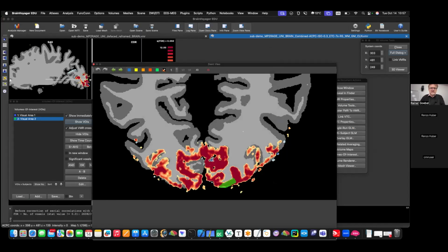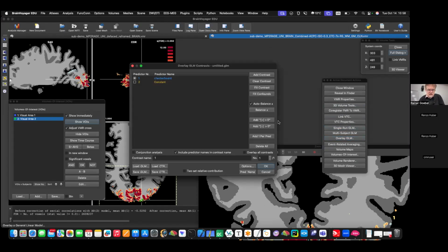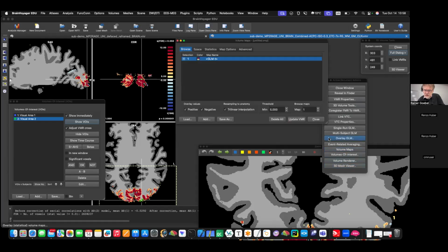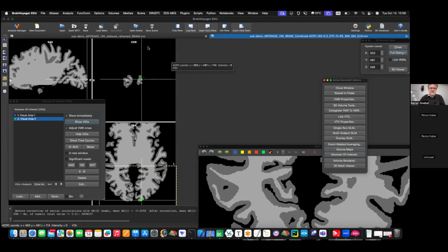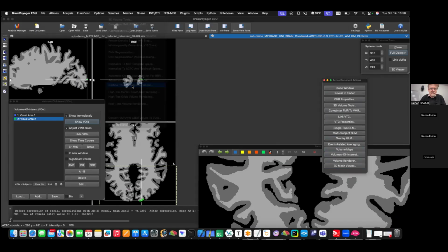So over this file, we now calculate a so-called thickness file. I just want to turn this one off so that we do not get confused. So now I go in the volume and say, calculate for me the Laplace equation and do a cortical thickness.